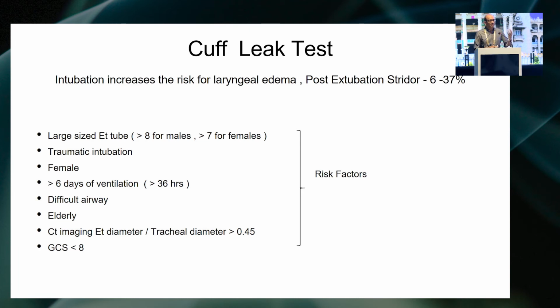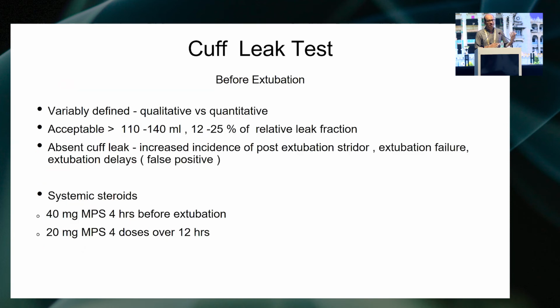Cuff leak to some extent gives us an idea about the probability of a stridor after extubation. So if a patient fails your cuff leak test, then you have the chance of giving him steroids, a small dose of methylprednisolone, about 40 milligrams of methylprednisolone 4 hours before extubation, which has been shown to decrease the incidence of post-extubation stridor.